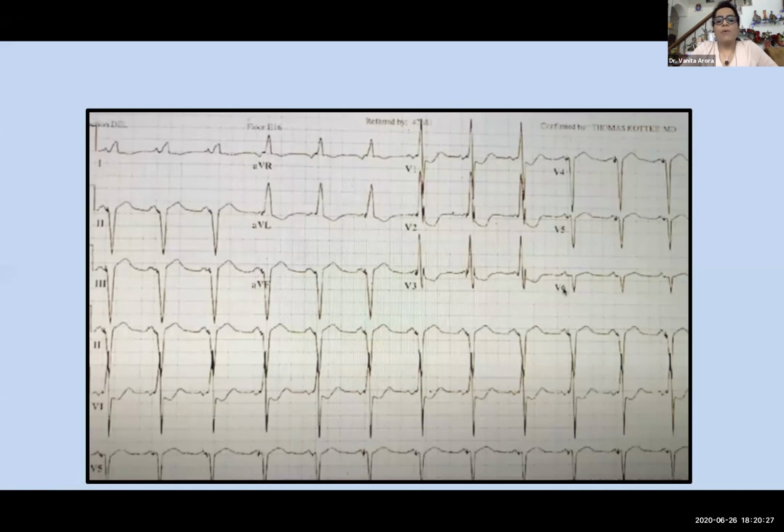And a word of suggestion here is that when you are doing biventricular pacing on the table, the most important lead that you can hook up to give you a better result is actually lead 1.